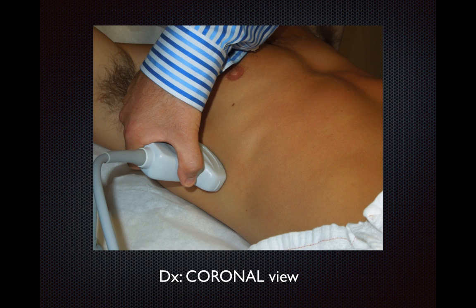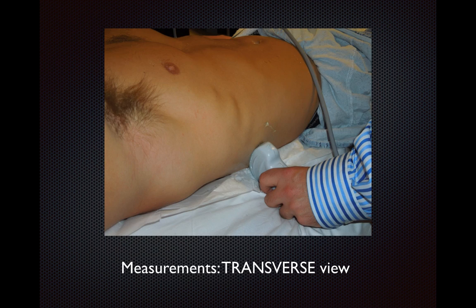First, to make the diagnosis of a pleural effusion, you want to place the probe marker in the coronal plane with the probe indicator pointing up towards the patient's head. Here you will look in the left upper quadrant and the right upper quadrant to assess for the presence or absence of a pleural effusion. If you do detect a pleural effusion, you turn the probe 90 degrees in the transverse plane with the probe marker pointing up towards the ceiling.